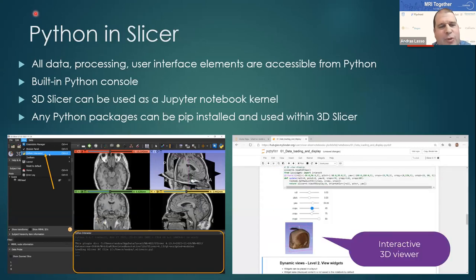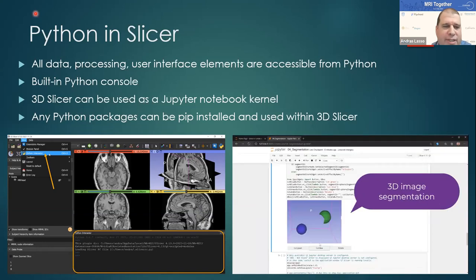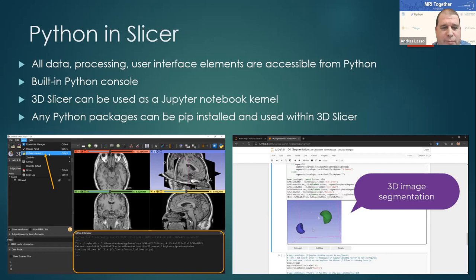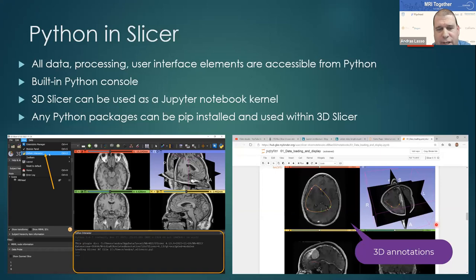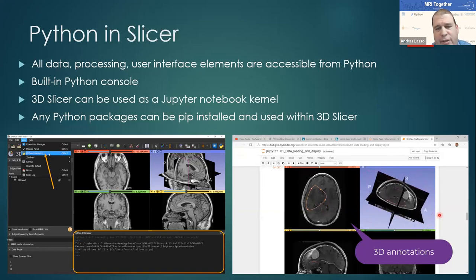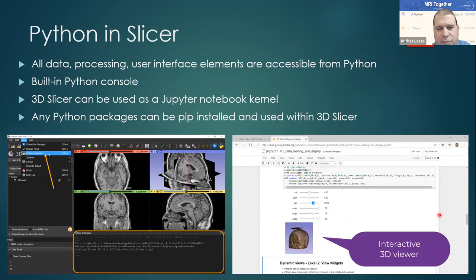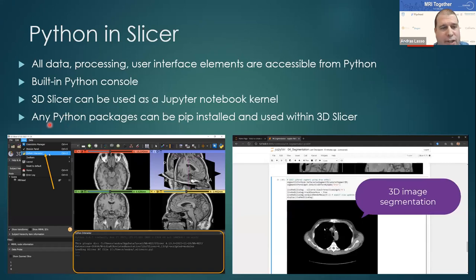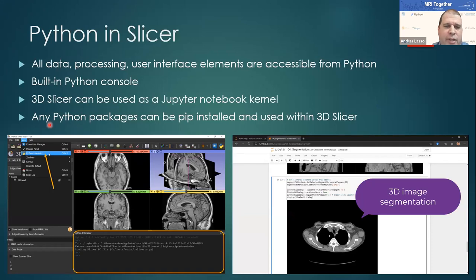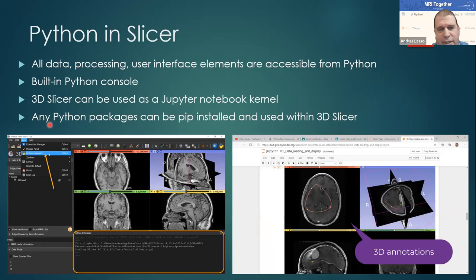An important feature is that all data, processing, and user interface elements are accessible from Python. You can open the Python console in Slicer and start interacting with any of the data or run custom processing. You can also run Slicer as a Jupyter notebook kernel, so all Slicer features — including visualization and Python scripting — are available in Jupyter notebooks. Any Python packages you develop or want to use can be imported into Slicer to provide input and visualize results.